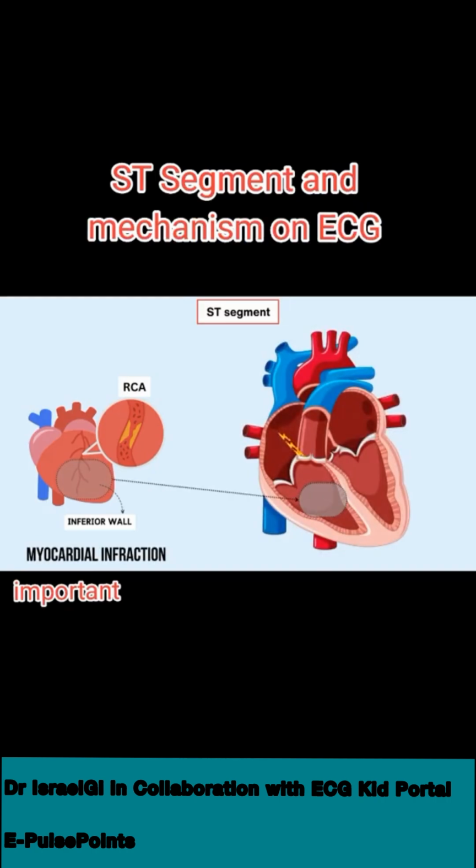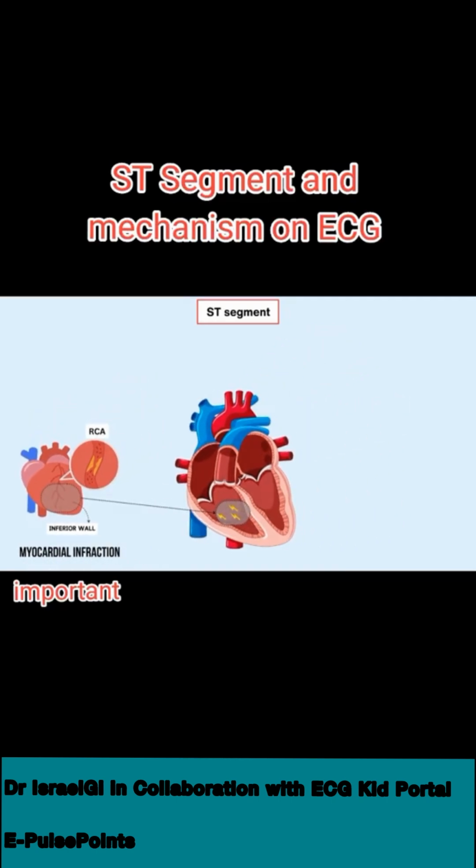The electrical signals that normally regulate the heartbeat also reach this damaged area, but they encounter disrupted and injured heart muscle cells. These damaged cells behave differently from healthy cells, causing electrical chaos. This disruption of the normal electrical activity in the heart manifests as ST segment elevation on the ECG, in leads that correspond to the inferior part of the heart.